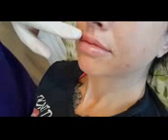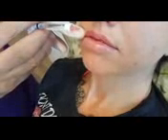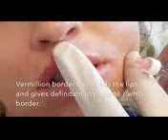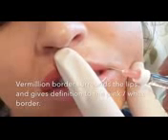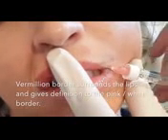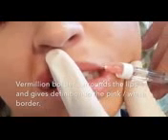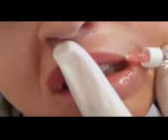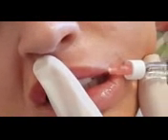All right, so I did over here, this whole section over here, vermilion border. All right, so here, the vermilion border comes all the way down here. This is a corner. So you can see the needle tip, right? You see the needle, I'm picking it up, and you flatten it, you pick it up.